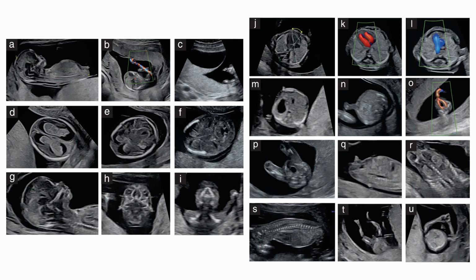So these are just all of the lovely images of the standard anatomy scan. Many sonographers are very particular because they're trained to get a certain image where they're looking at the landmarks of the baby's body to make sure that they're getting the right measurement. Because if you are off just a little, that can make the measurement very different. They also have to get certain images to show documentation that what they're finding is truly there.